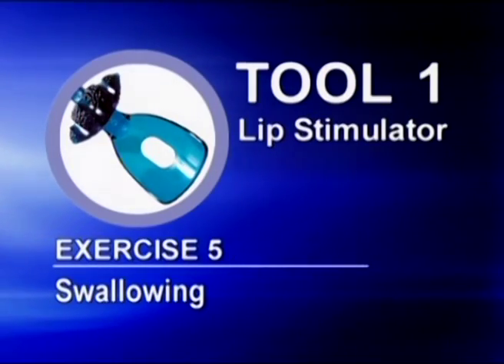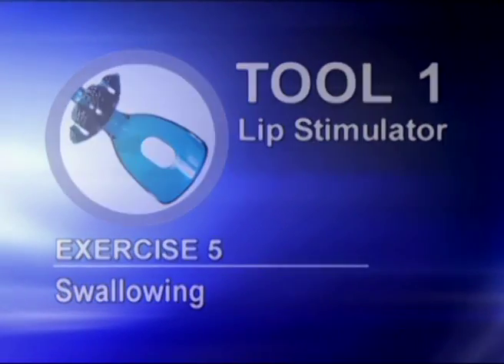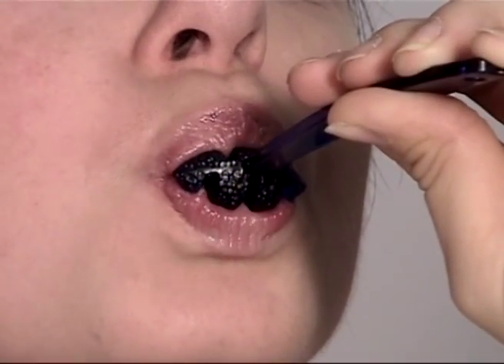The goal of exercise protocol 5 is accuracy of swallowing. Use water to moisten the mouth. Place tool number 1 on the palate behind the front teeth. Place tongue tip in the hole opening. Bite teeth on the handle, swallow with lips against the football shape.